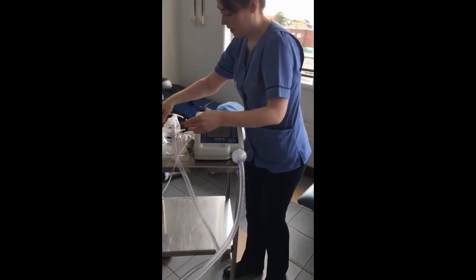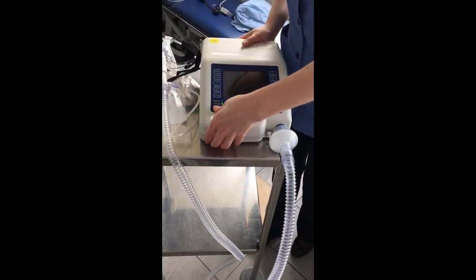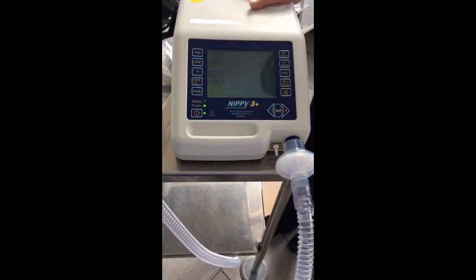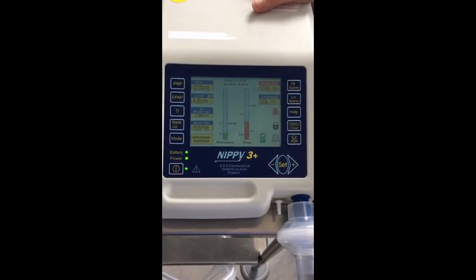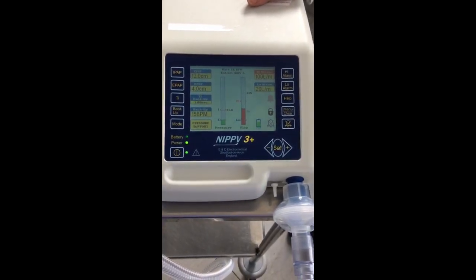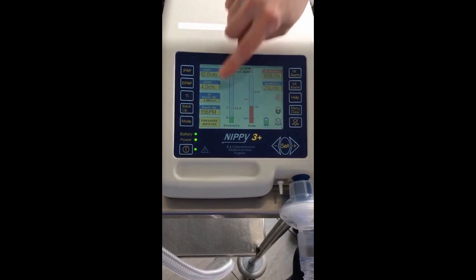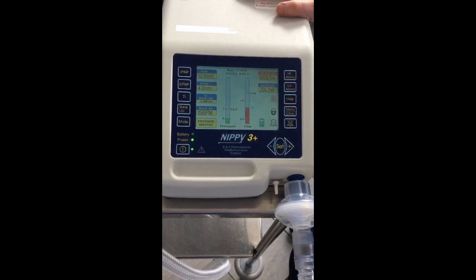The next thing we need to know is how to input our settings into the machine. I'll turn the machine on. For basic training we're only going to focus on the IPAP and EPAP. To give bi-level positive airway pressure we need two readings: inspiratory positive airway pressure and expiratory positive airway pressure. These will be prescribed by our team, and we ensure our mode is set to pressure support.